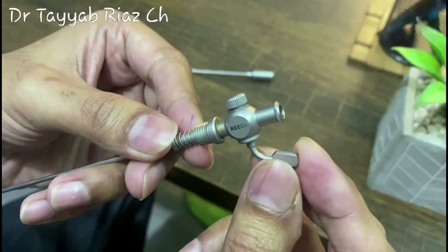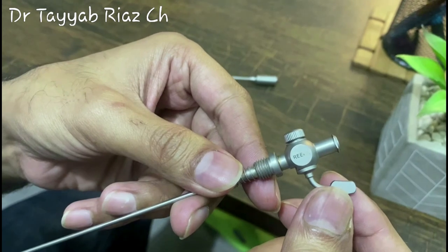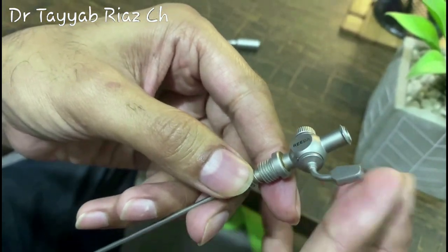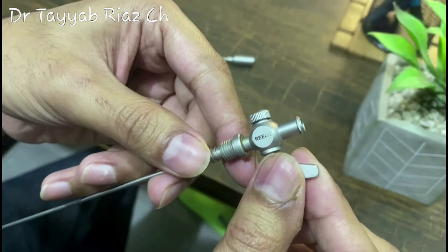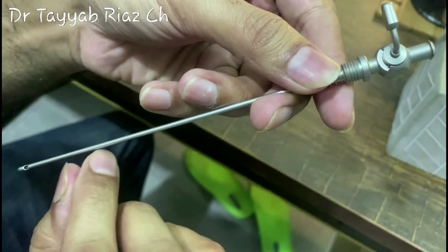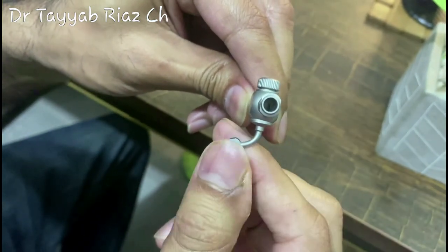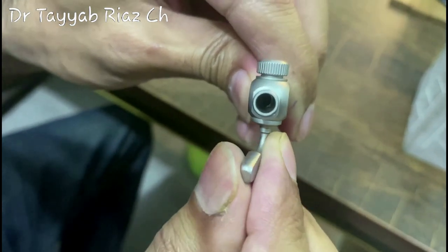There is a valve at the upper end of the Veress needle, and this valve is to control the flow of carbon dioxide through this needle, and there is a small screw on the opposite side to tighten this valve. When this valve is parallel to the shaft of the needle, the channel is open, and when it is at right angle to the shaft of the needle, the channel is closed. There won't be any flow of carbon dioxide. And if you look through the needle, moving the valve opens and closes the channel.